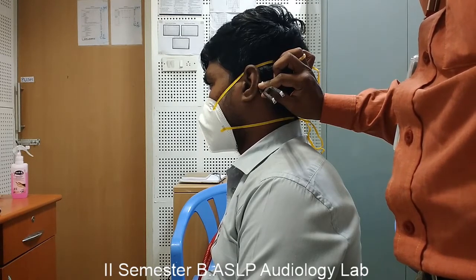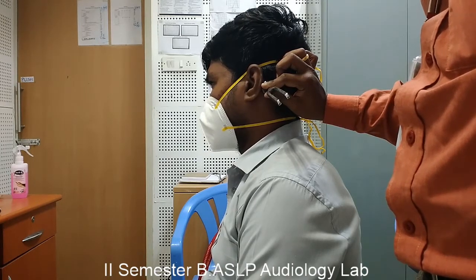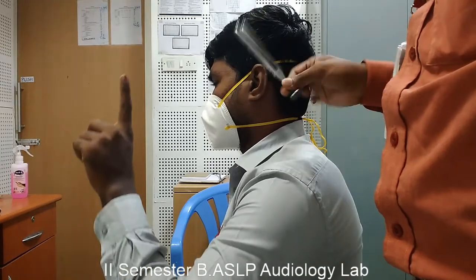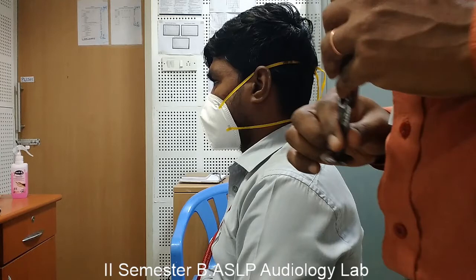As soon as the subject indicates that he has stopped hearing through bone conduction mode, we need to shift the tuning fork to in front of the ear canal to check if he or she is hearing through air conduction. If the subject indicates he is hearing through air conduction even after indicating that he is not hearing sound through bone conduction, that indicates air conduction hearing sensitivity is better than bone conduction hearing sensitivity, which determines that the subject has normal hearing or sensorineural hearing loss.